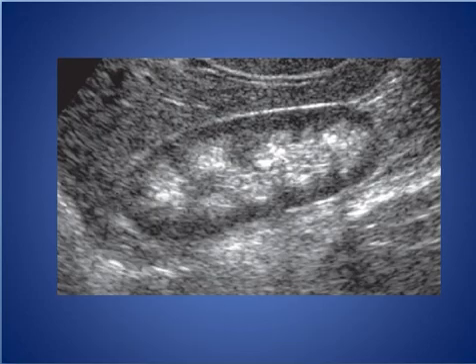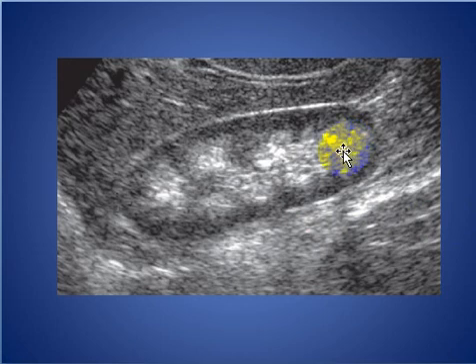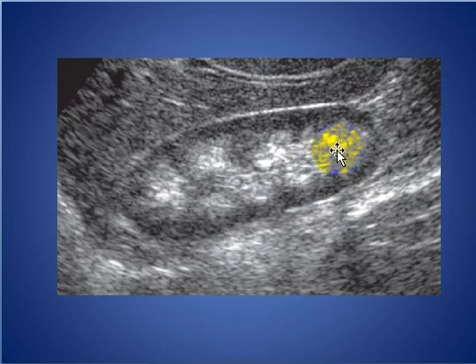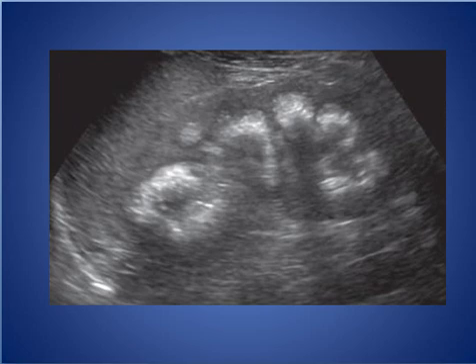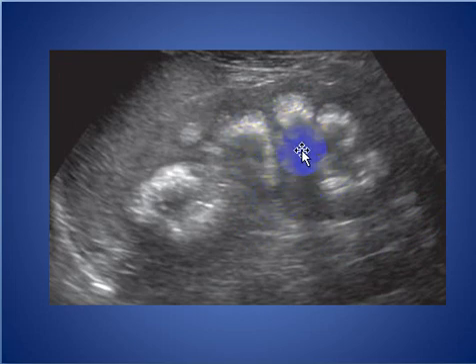Here is another patient with medullary nephrocalcinosis. We see increased echogenicity of the medulla with a rim-like pattern in the medullary pyramids. Several of them show shadowing calculi. Here are more severe cases of medullary nephrocalcinosis, showing medullary calcification with shadowing in patients with renal tubular acidosis.